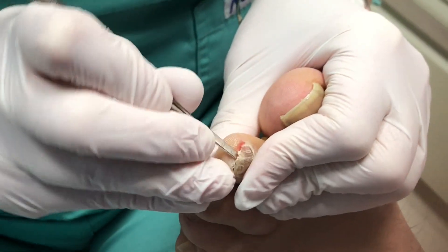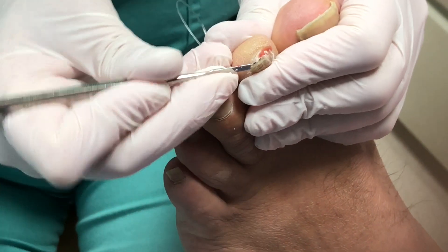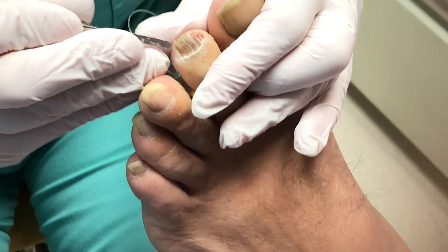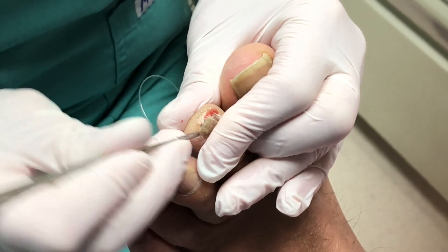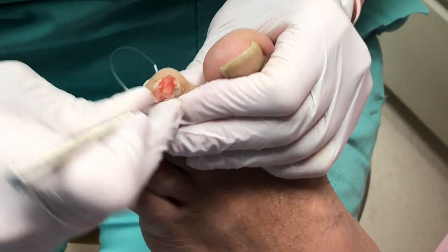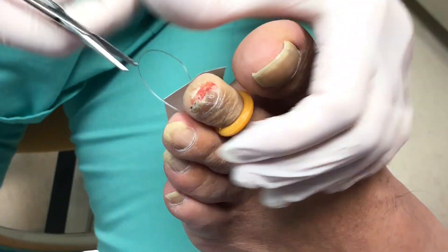Release the suction — I'm getting there. Even the color of the nail from all the bruising and such that's going on with it. How you doing there, my friend? Awesome. There we are. Say goodbye. Goodbye.